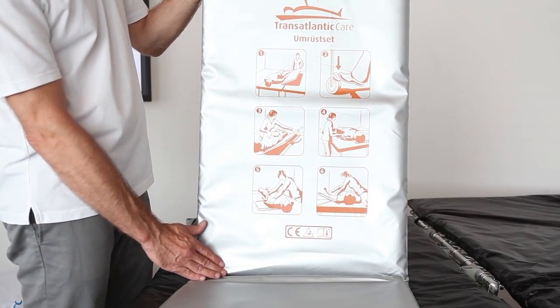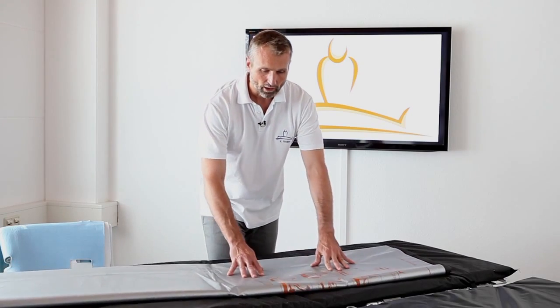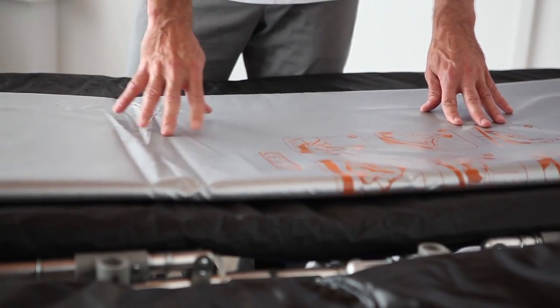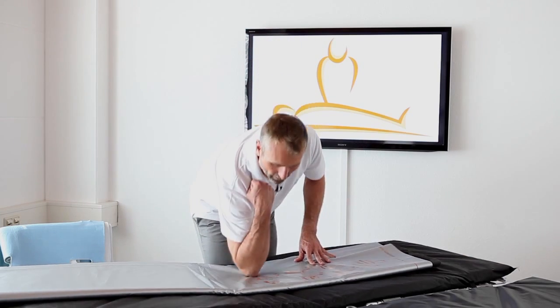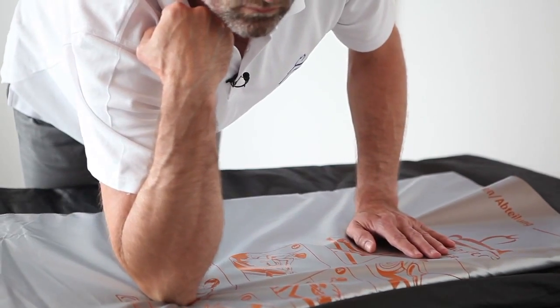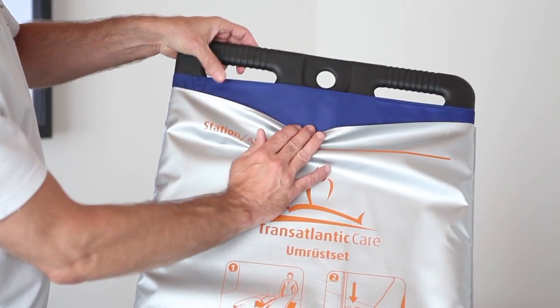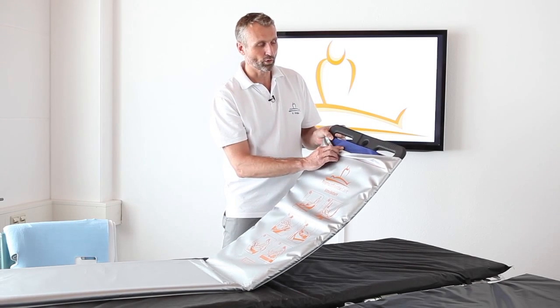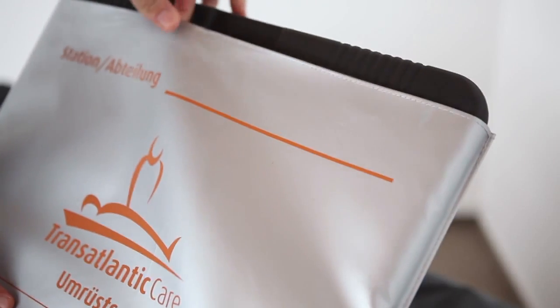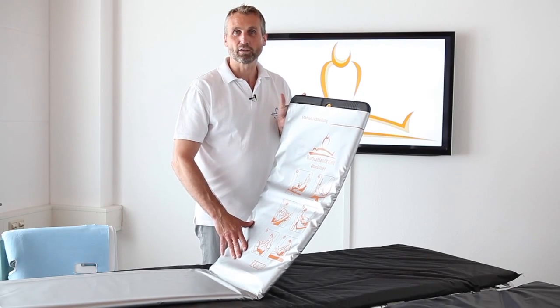With the full setup we have the best sliding effect ever — you see the foil is sliding. But even if I put punctual pressure on it, it is still sliding. The secret of the sliding effect is that the full setup is a three-part system: it is the body that we know, it is a blue casing, and it is a silver foil.